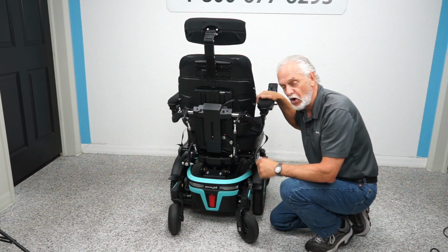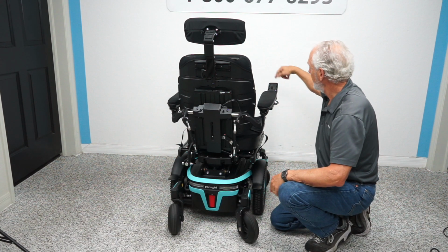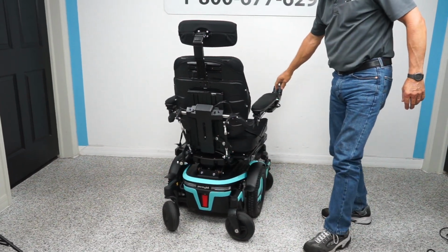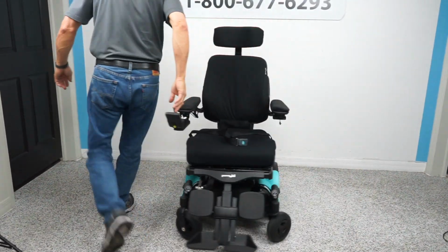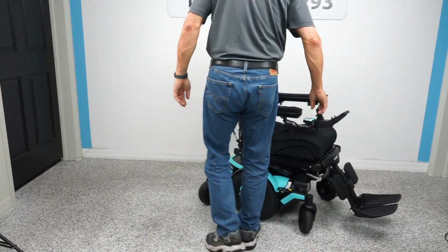It is hard to turn on when you have it off, okay? So I turned it back on. I'm going to turn the power back up front. Now this is a mid-wheel drive chair, so it turns on its own length. So if you have it in the house, that's what you're looking at.